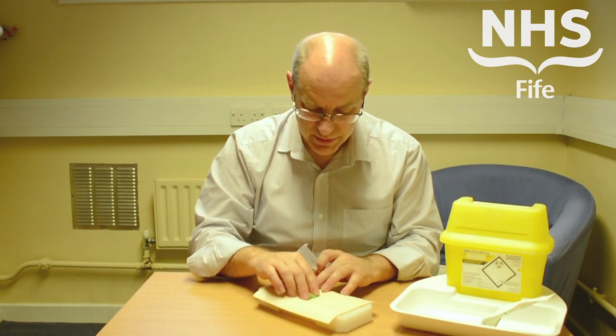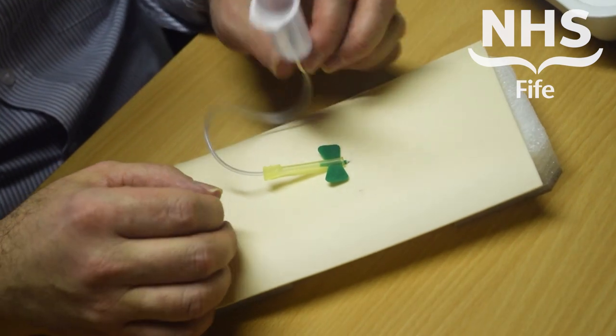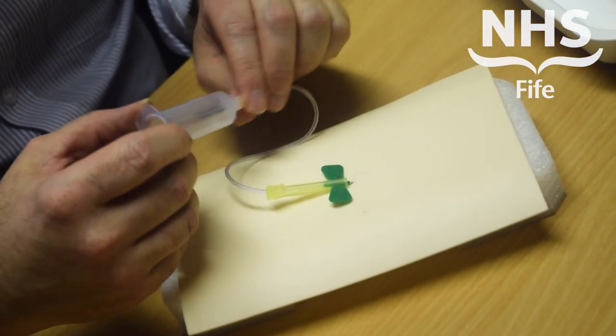Insert the device into the patient. That can then be secured with tape as appropriate. You can then take your blood samples as required using the vacutainer system.